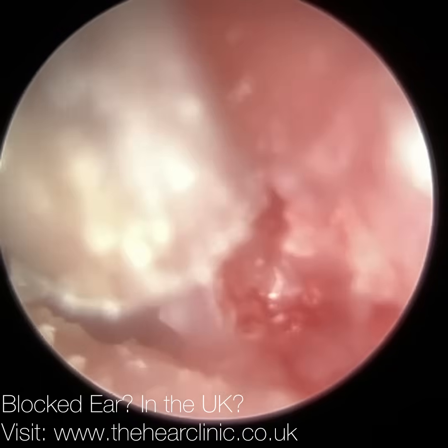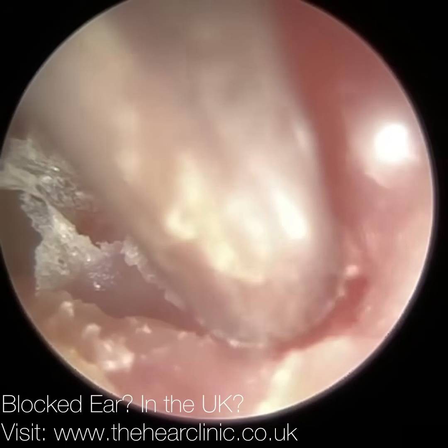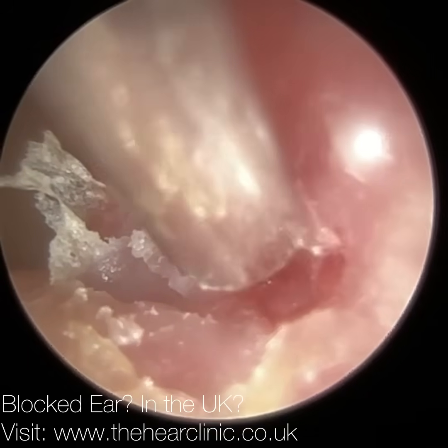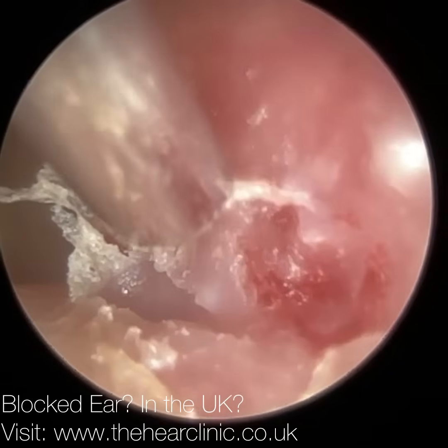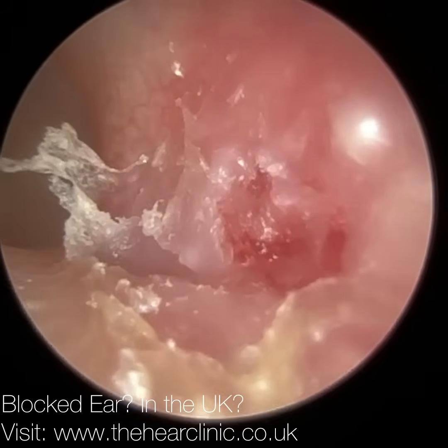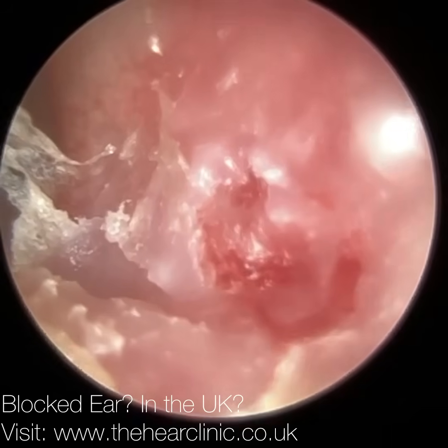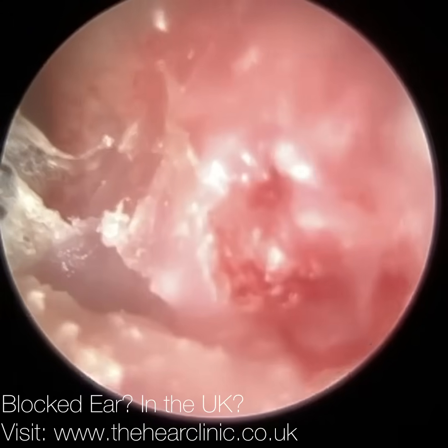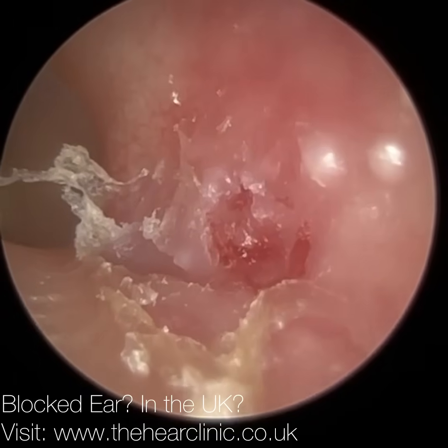But this patient is aware that we're going to have to refer them to ENT. I've referred to the GP in the first instance, and whilst the referral is being processed, I've just invited this patient back after their course of medication so I can re-examine the ear and see what's going on. As you can see, there's no active bleeding there but you can see there is some vascularization on the surface of the skin.